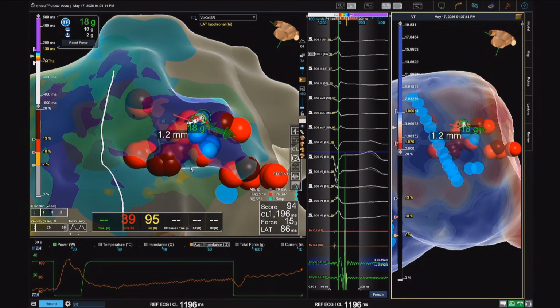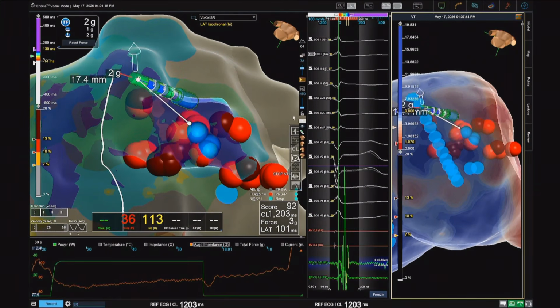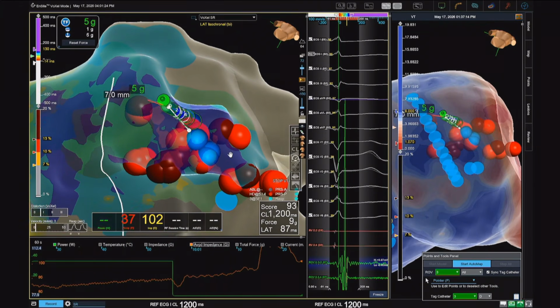That's a live case with my cough also. Yeah, so you have the idea. You have to pull back and stick it underneath the mitral. Yeah, exactly. Well, I've seen you ablating with 35 watts. Is that the regular setting? 35 watts, and you said what, 50 seconds?